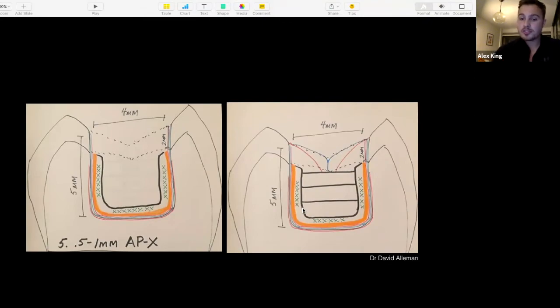Whereas if you're just doing 1 millimeter layers, you're effectively just having a very flat layer and bonding to one surface. Even though you're semi on the walls, the fact that they're so thin, 1 millimeter layers, you've only got a C factor of less than 2, so you're not stressing out the actual tooth. But that's for another lecture.